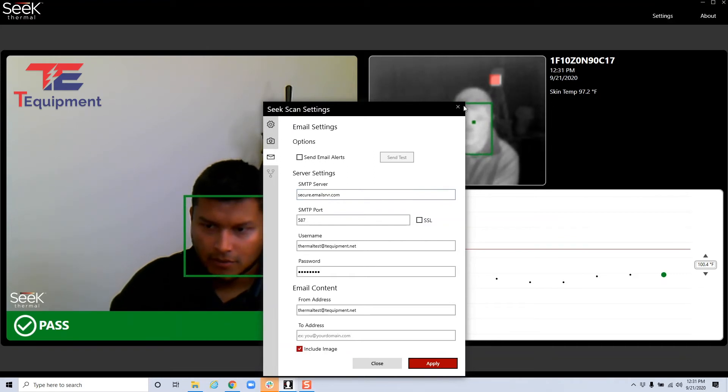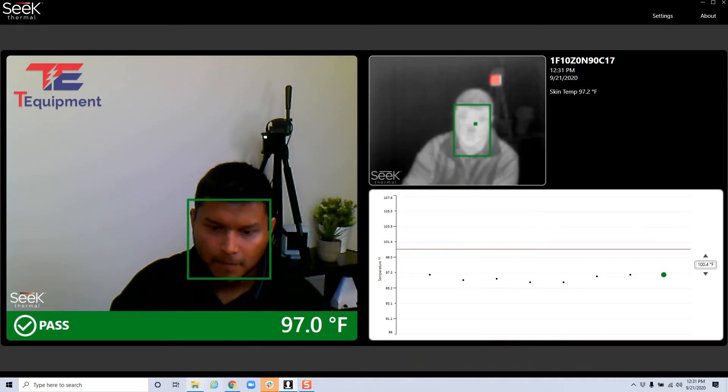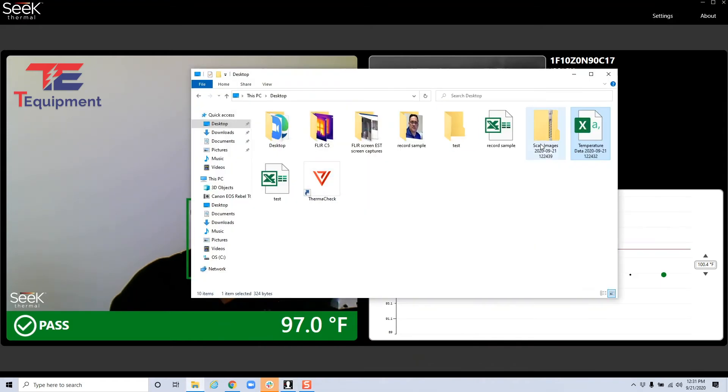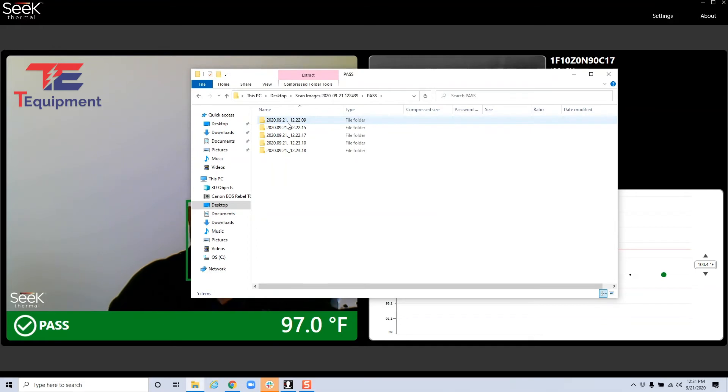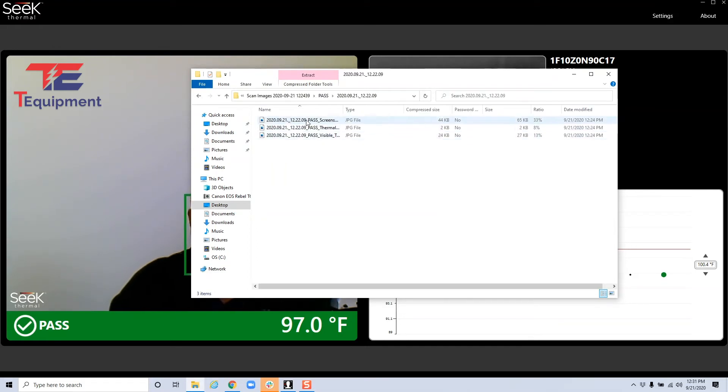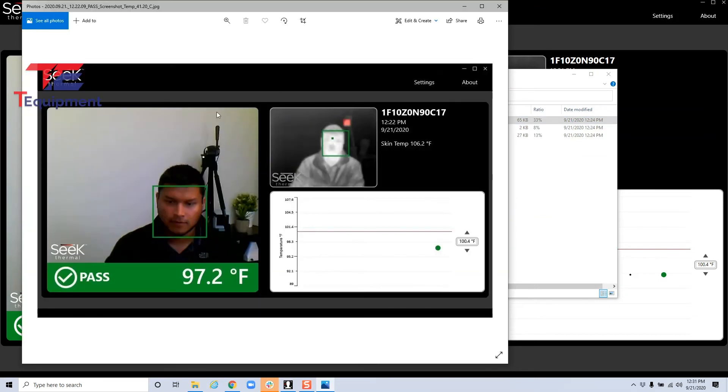So let's go ahead and actually go into our desktop and look at the export. So for scan images, you'll have a pass and a fail folder. In this case, I only have pass. And there's three options.